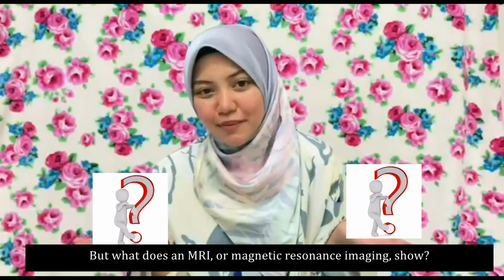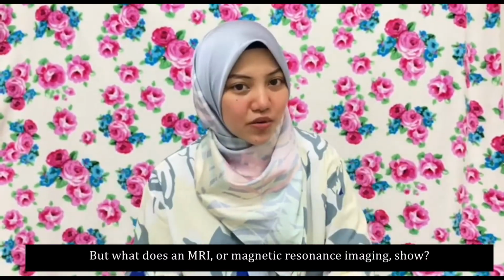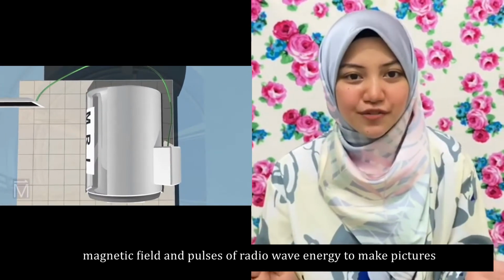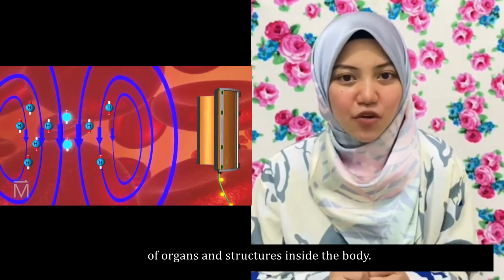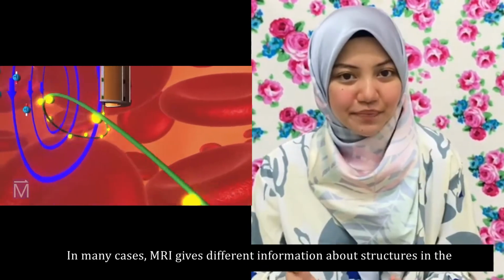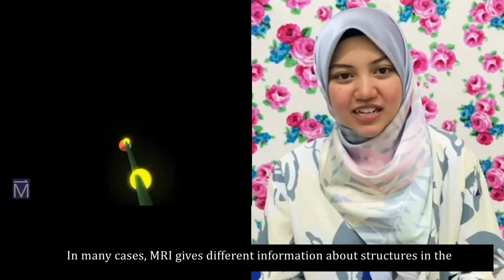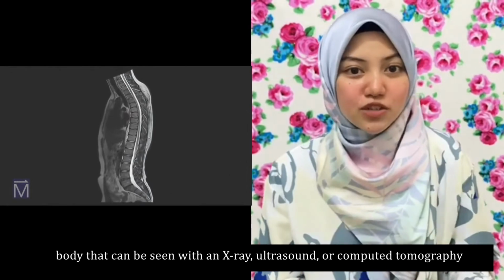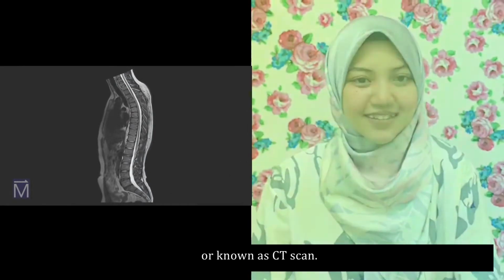What does an MRI or magnetic resonance imaging show? To begin with, magnetic resonance imaging is a test that uses a magnetic field and pulses of radio wave energy to make pictures of organs and structures inside the body. In many cases, MRI gives different information about structures in the body than can be seen with an X-ray, ultrasound or computed tomography, known as CT scan.